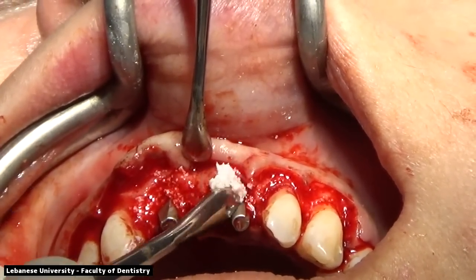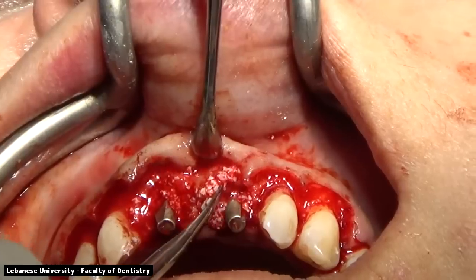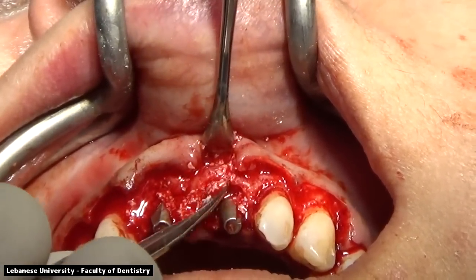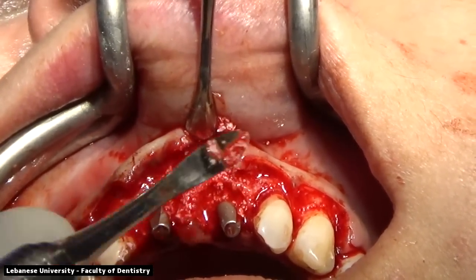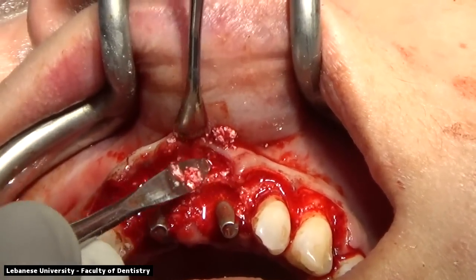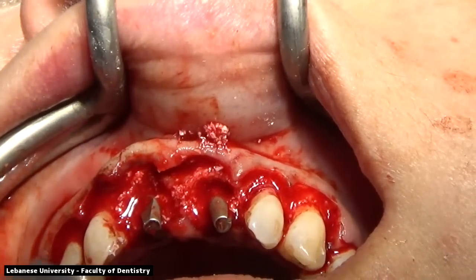Since we have a thick buccal plate of bone again and a thick soft tissue, and we do have a socket area where the bone will be contained between the implant and the buccal plate of bone, there is no need for a membrane that will help in the containment of the particulate bone graft that we are placing. And this particulate bone graft will decrease the amount of remodeling of the buccal plate of bone and allow for better healing and better support of the buccal plate of bone, thereby supporting the soft tissue and preventing collapse of the soft tissue.